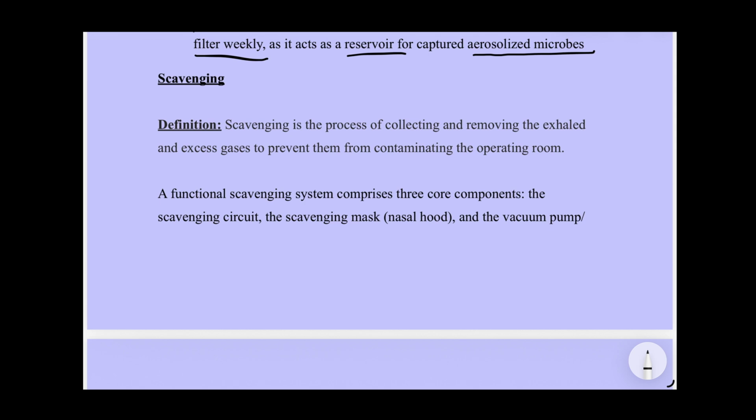So if a clinician has unscavenged operatories, ambient nitrous oxide concentration in the dentist's breathing zone can soar between 3800 ppm to 24,000 ppm. If the clinician has scavenged operatories, active scavenging brings levels down to the manageable range of 33 ppm to 409 ppm.